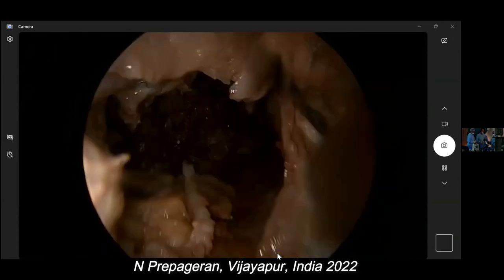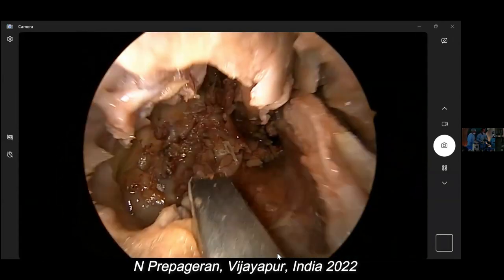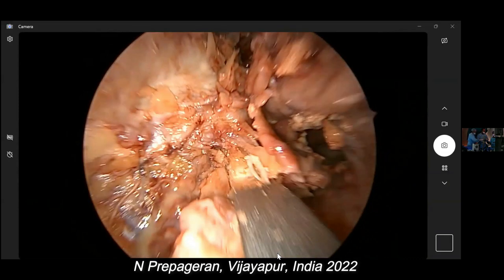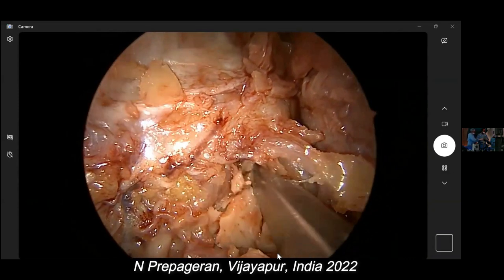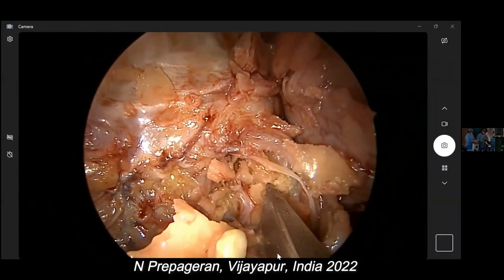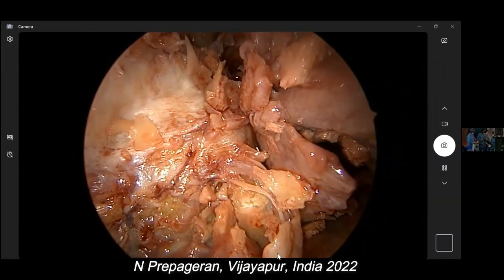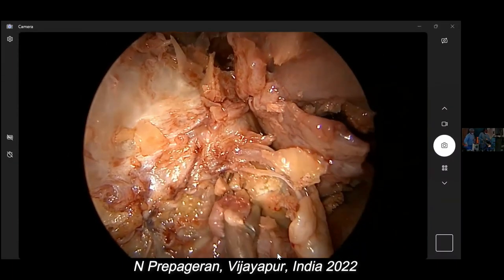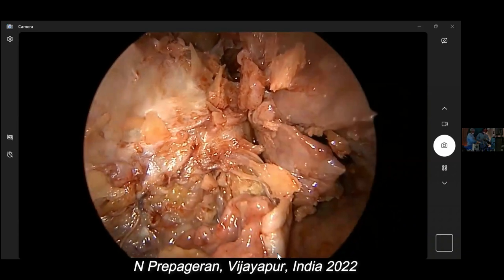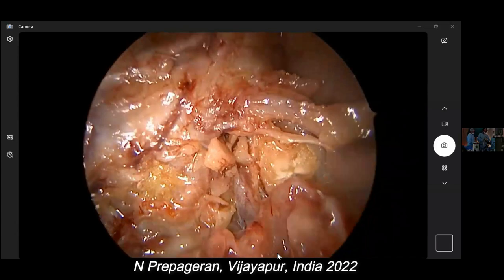So now we need to see. Still got bone. My goodness. You all chose the thickest bone possible for me. But good, see how we manage a difficult case. Then for you, it'll be easier. There, the descending palatine.